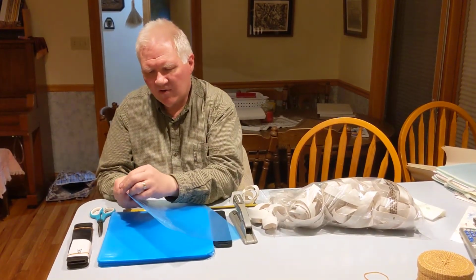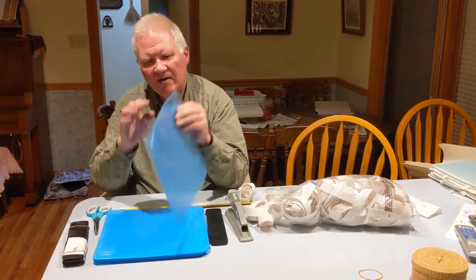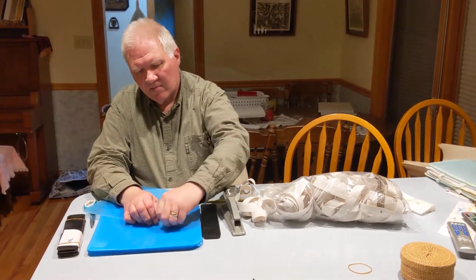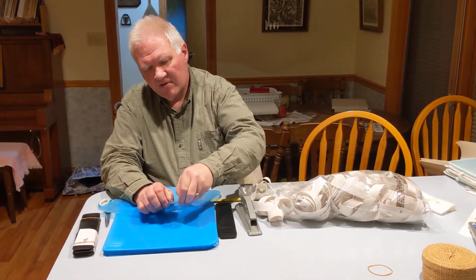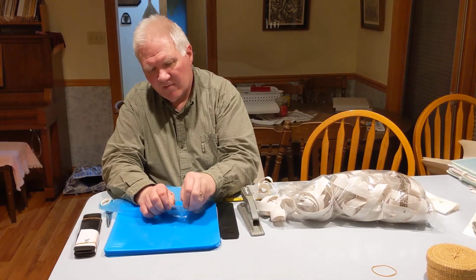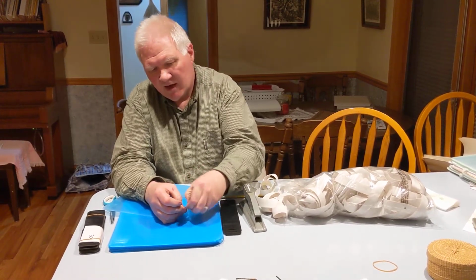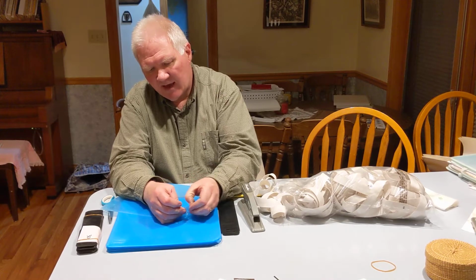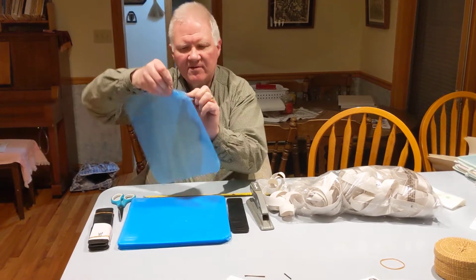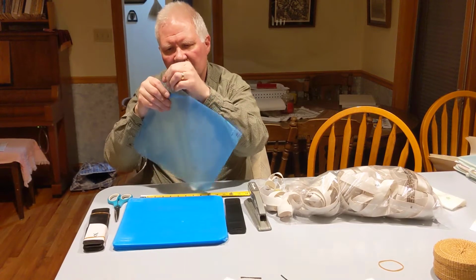If you use a fingernail, or if you can't get it with your fingernail, you could use an X-Acto knife to try to peel the edge, and once you get used to it, it's not too difficult to peel away the corners of this protective film on the PETG plastic. So the first step to prepare the plastic would be to peel back these corners and then leave them just hanging, because then when they're being used by medical personnel, this loose part can be used when they peel it back before they use it in their clinical setting.